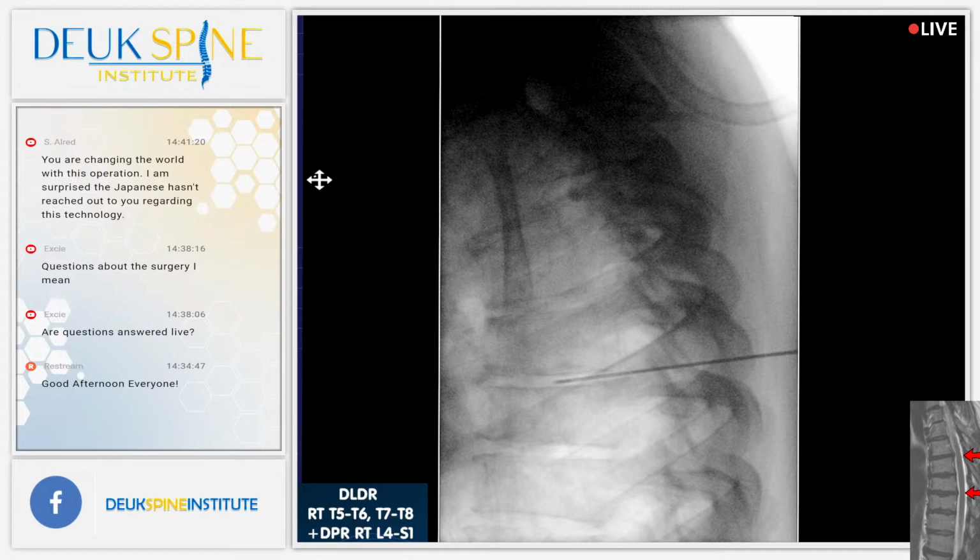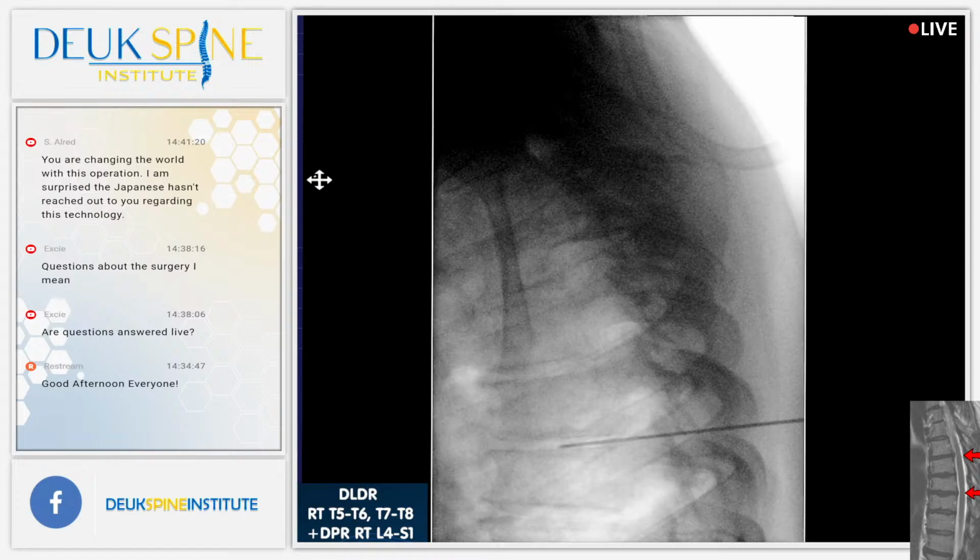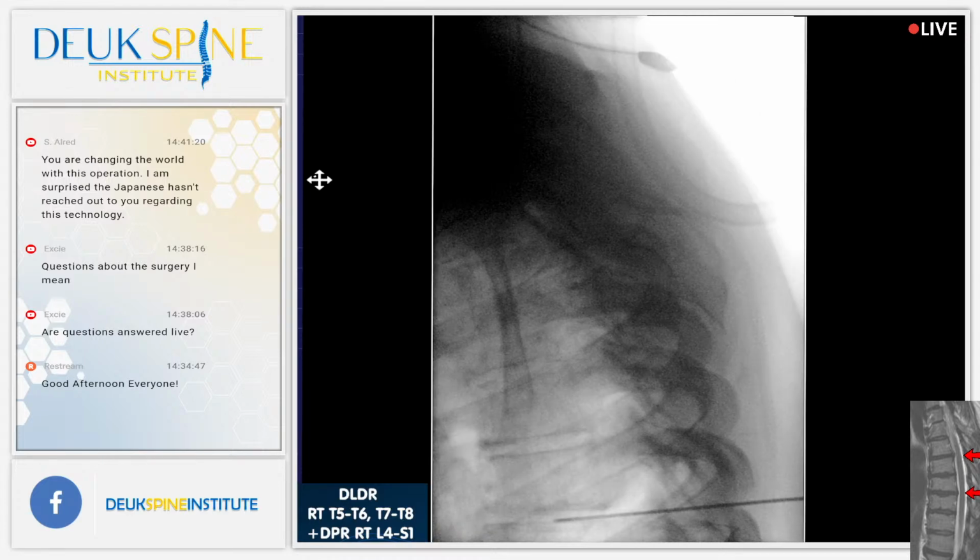Well, oh no. All right, so Jordan, can you get us on the 5, 6 disc better? I need to see down the axis of the disc. What is that thing there? That's the scapula? That's just the scapula in the way. All right, I think you're off on orbit, and I think you're off on wag. So let's try to orbit and wag it.